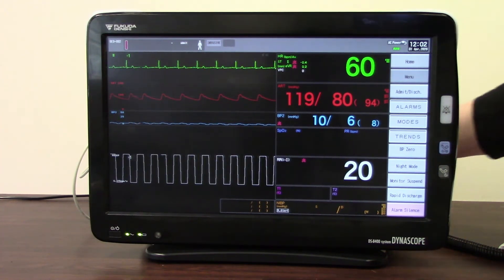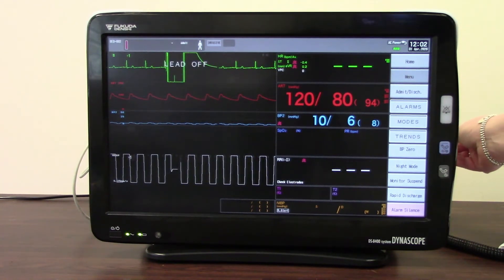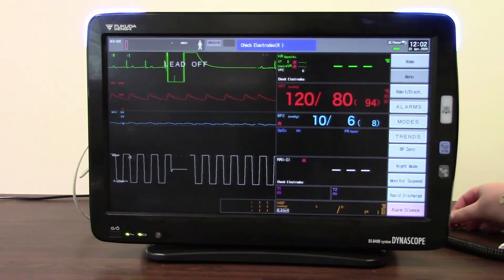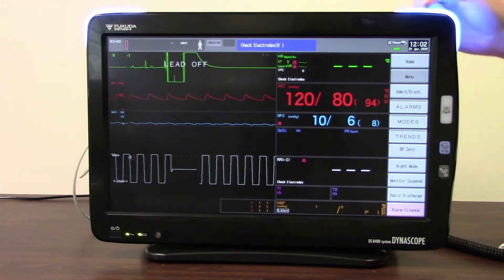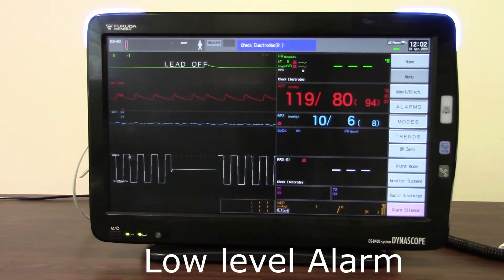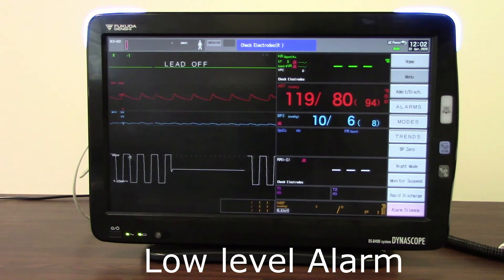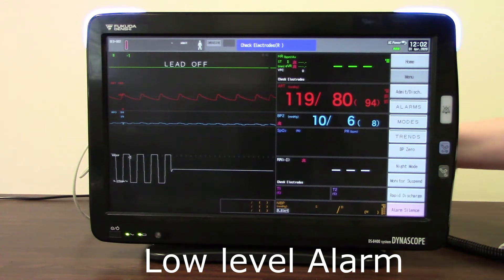First of all, if we listen to a low level alarm — such as a lead off condition — you'll see the monitor will flash with blue lights. It will also let you know that there is a lead off condition and it will alarm every few seconds. So nothing too intrusive.